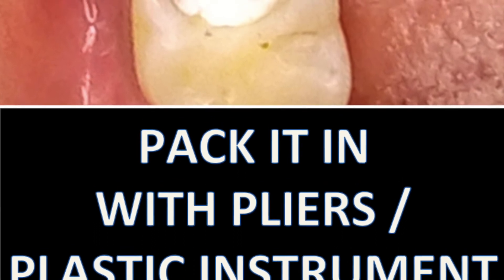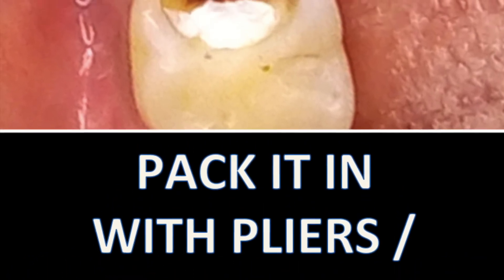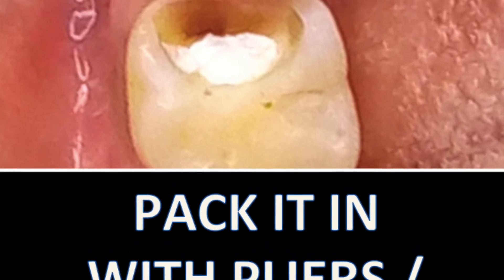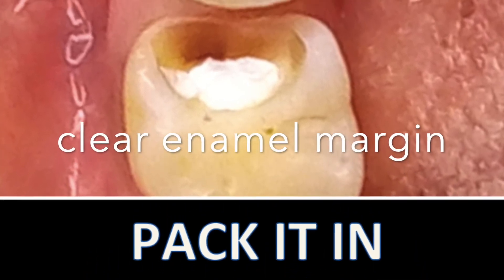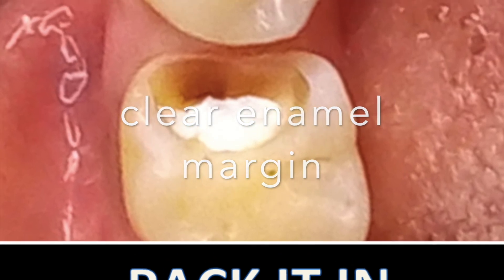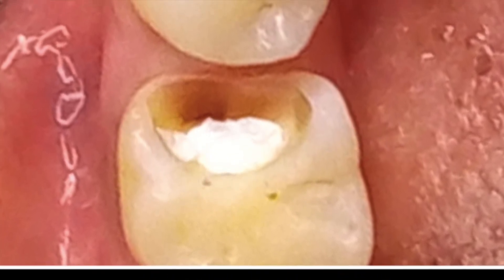Also note here that I have prepared the tooth to expose a clear enamel margin along the periphery, and this is what I will harness when I restore the tooth finally with light-cure resin after completion of obturation.